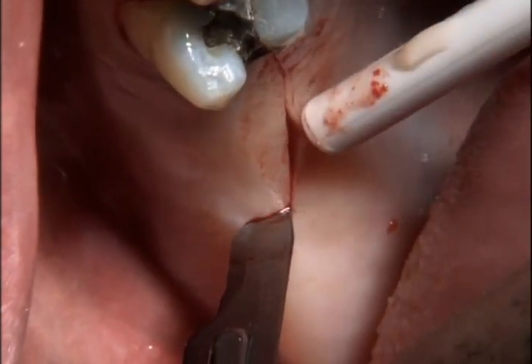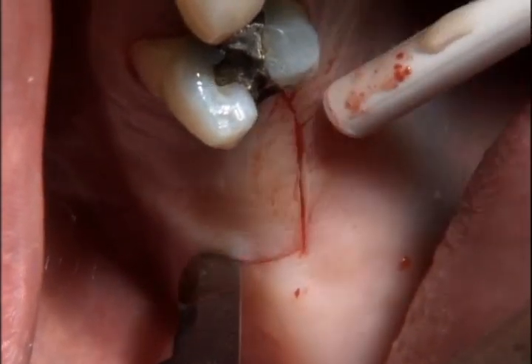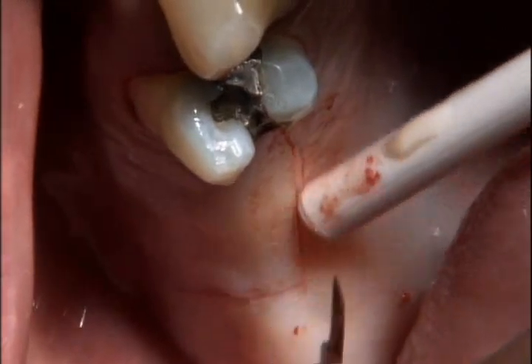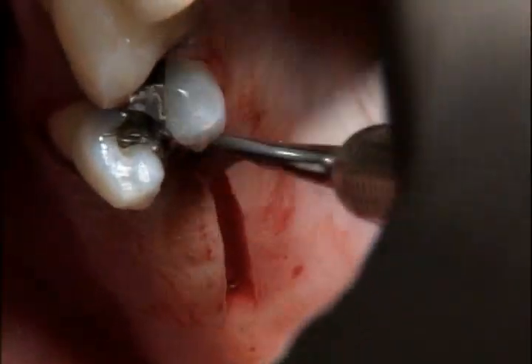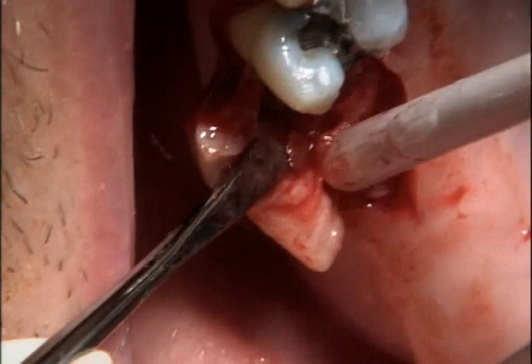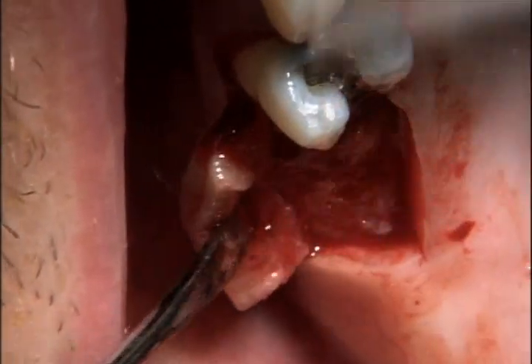However, a vertical releasing incision was used at the distal termination of the flap to provide sufficient access to the underlying bone. Having made these incisions, a full-thickness mucoperiosteal flap was raised towards the buccal in order to expose the intended implant sites.